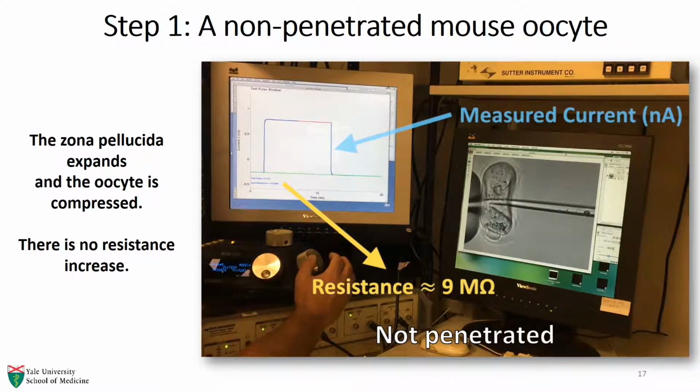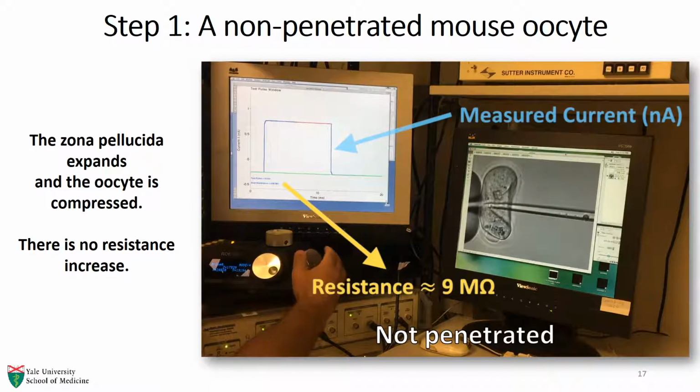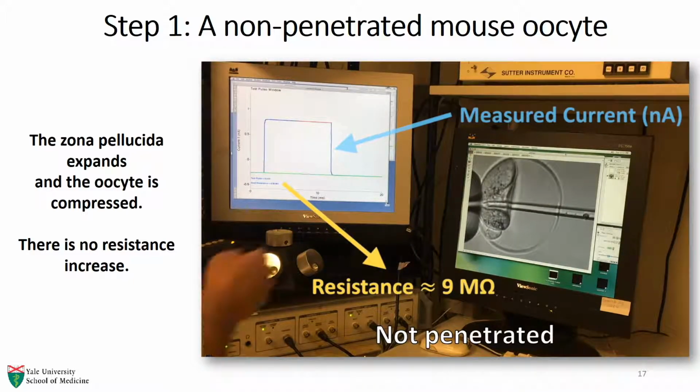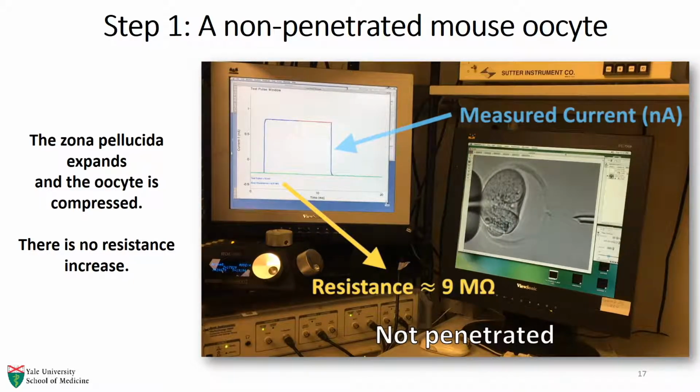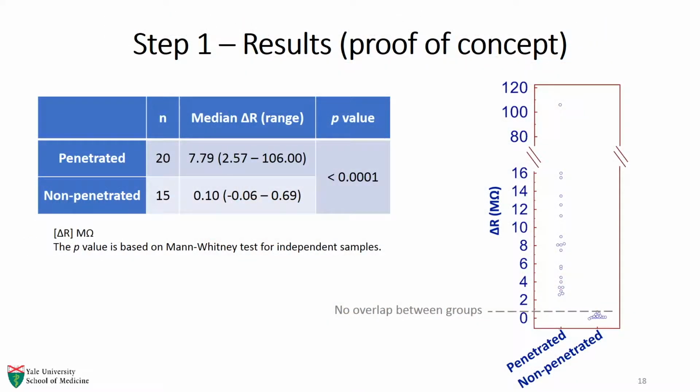In contrast to the previous video, the following video shows that there is no resistance increase if the oolemma is not pierced. The summary of the proof of concept experiments shows a significant resistance increase in the penetrated group only.